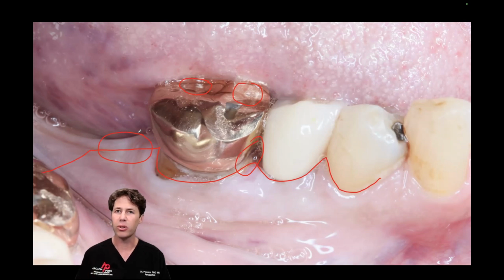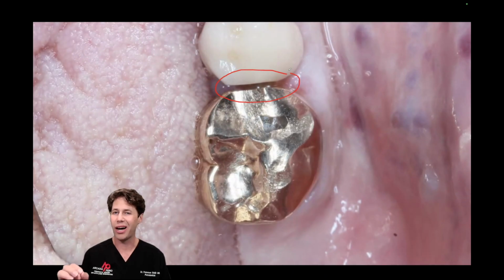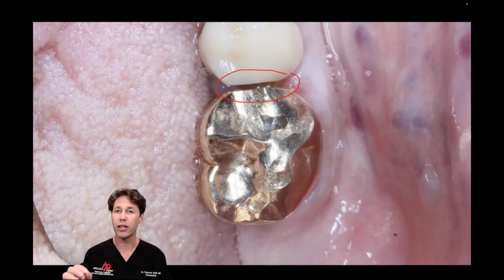But let's look at this tooth from an occlusal view. Again, you can see those non-workers. You can see the open contact, which led to the food impaction, which was likely the cause for the caries at that area in conjunction with the heavy occlusal forces. This tooth had a very poor prognosis, both endodontically, restoratively, and periodontally.